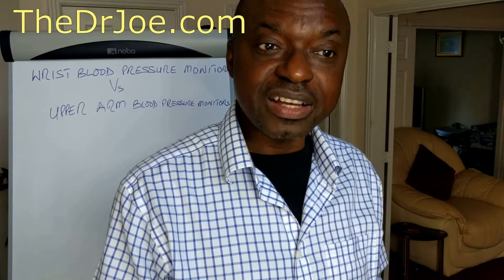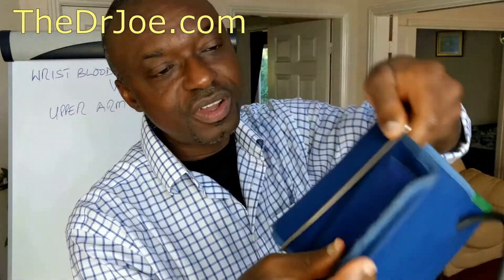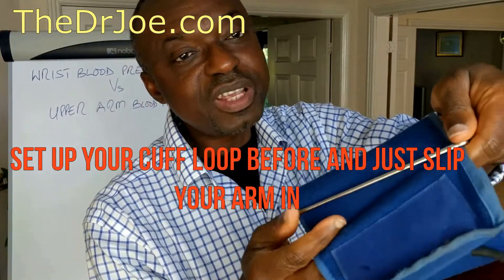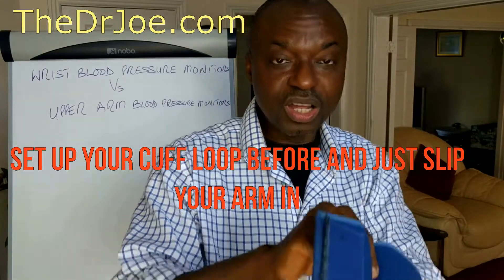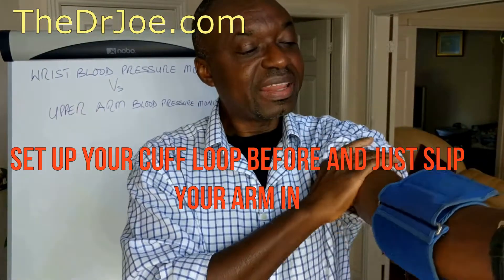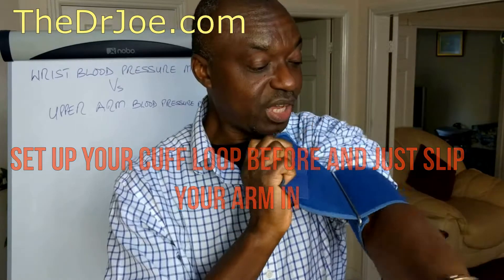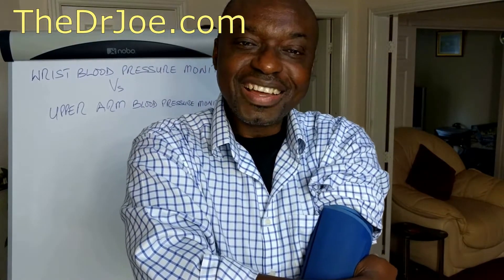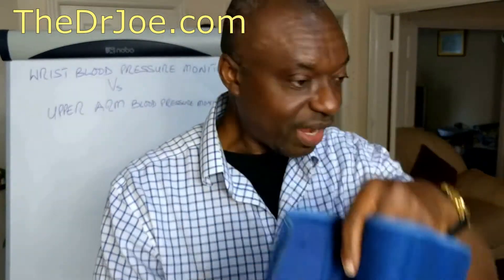The other issue is that to use the upper arm monitors, it does require a certain amount of dexterity, and some people have issues with that. Here's what I say: always thread the free end of the cuff through the metal guide — have it threaded through all the time. When you're going to measure your blood pressure, you just slip your hand and forearm through, then slide it up. Because it's already threaded through, all you then need to do is fasten. Simple as that — ready to go.